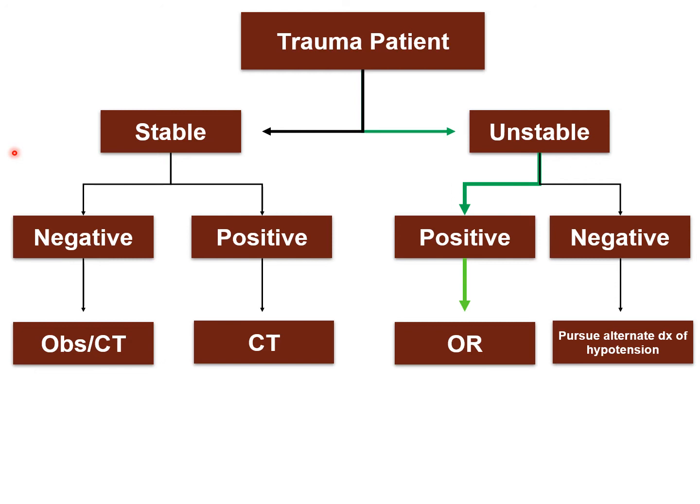You do it at teaching hospitals because you want the educational opportunity. You do it at trauma centers because your trauma algorithm primary survey has to be rote. It has to be the same on every patient, because if you do a FAST exam on every patient, then you will never forget to do a FAST exam when you should do one. And if you're sort of picking and choosing when to do the FAST exam, sooner or later you will forget to do it on a patient who needs it. So that's one reason we do it on everybody.